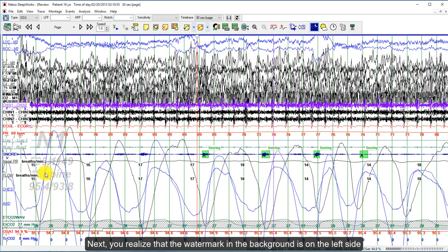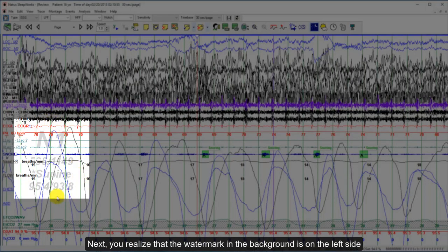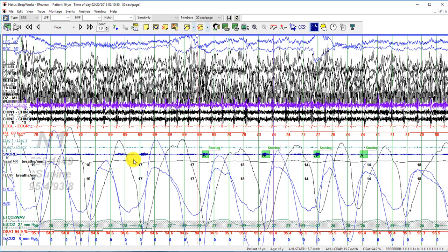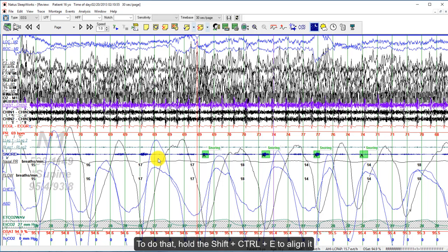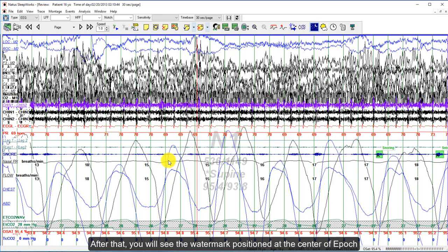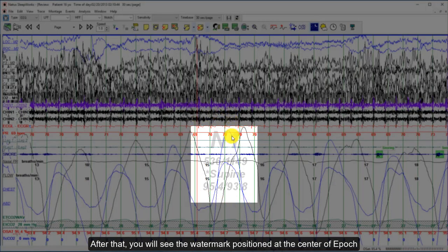You will notice that the watermark at the background is on the left side. What you need to do is align it to make sure it is at the center. To do that, simply hold Shift, Ctrl, and E to align it. After that, you will see your watermark at the center of the epoch.